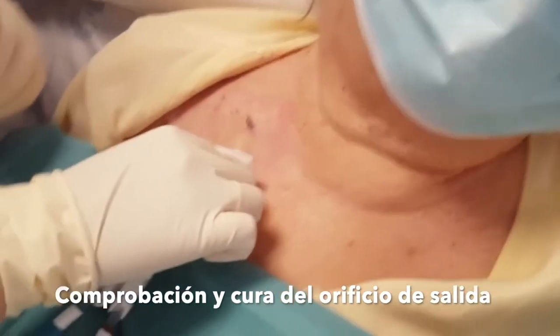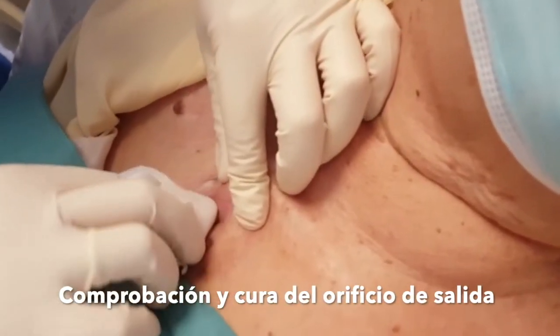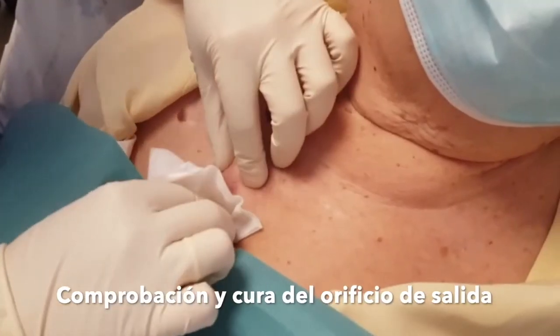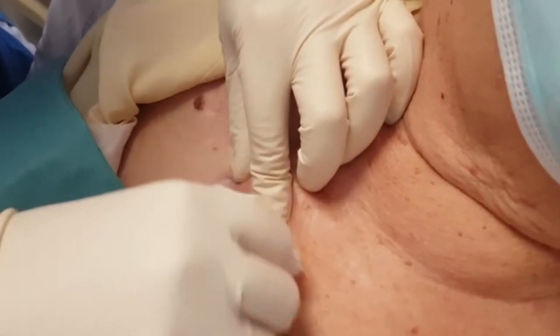First, the catheter exit site is examined and disinfected, ensuring that there is no secretion, no crust, or signs of infection, either in the area of the exit site or in the subcutaneous catheter tunnel. In this case, the hole is slightly red.